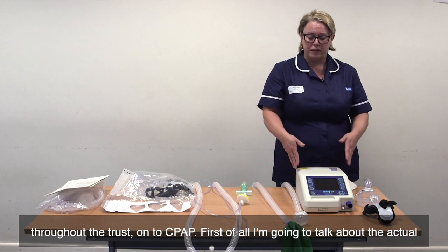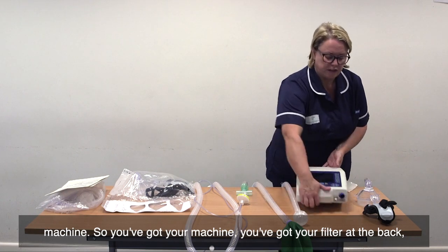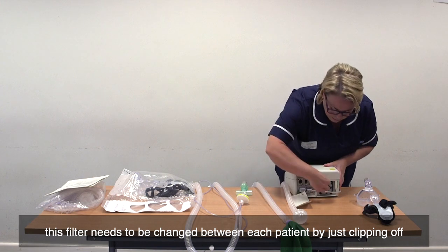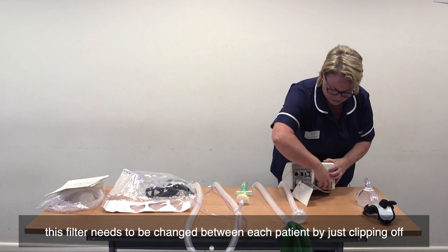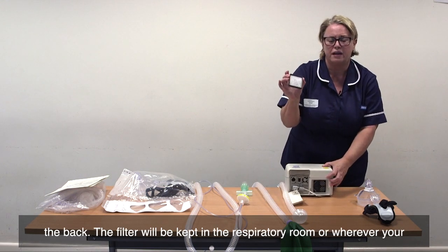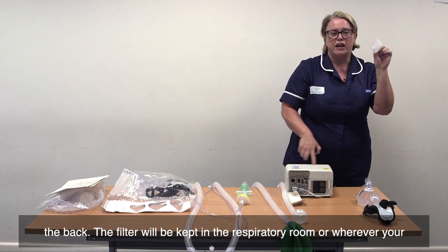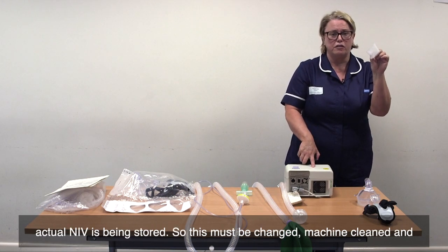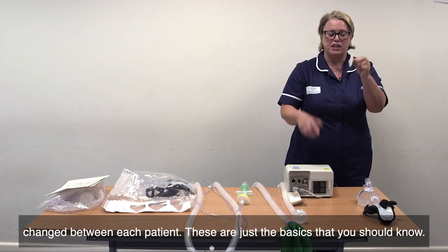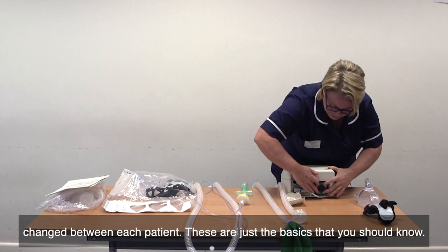First of all, I'm going to talk about the actual machine. You've got your machine, you've got your filter at the back. This filter needs to be changed between each patient by just clipping off the back. The filter will be kept in the respirator room or wherever your actual NIV is being stored. This must be changed, machine cleaned and changed between each patient.